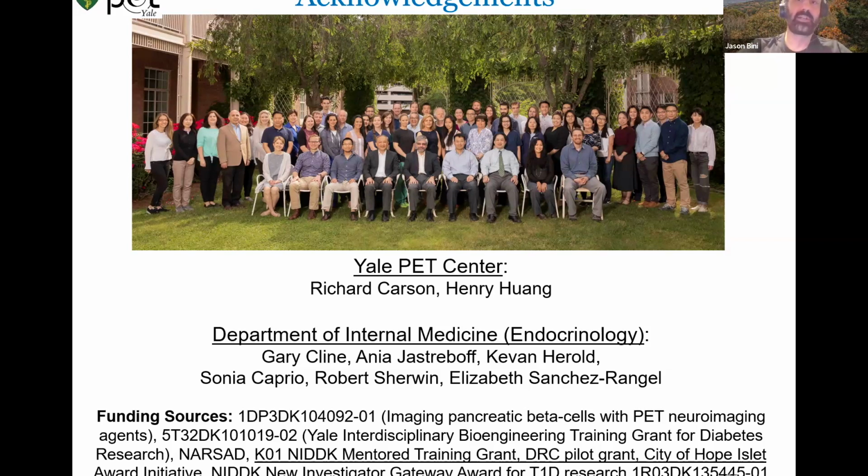I will say that some of the technology now for the PET scanners themselves is getting to the point where we can do whole body imaging and inject radioactive doses of 1/100th of what we do now. Because the machines are so sensitive and some of our image reconstruction algorithms are getting very good, we theoretically are at the point where we can get down to scans that would be the same as a cross-country flight for the amount of radiation. Those are still in the works, and we'd have to validate those a little bit more. But I could see within 5 years or so being able to do those kind of scans in pediatrics.